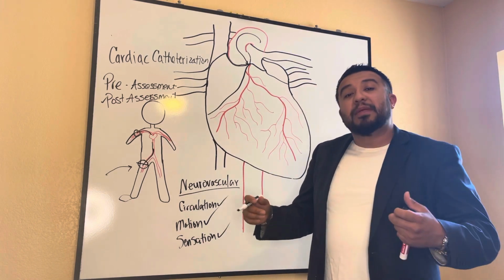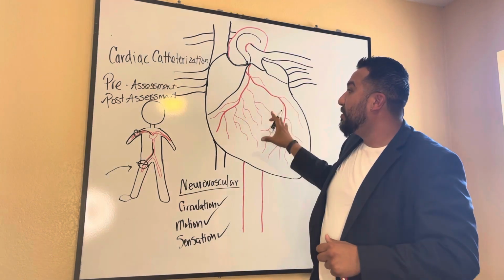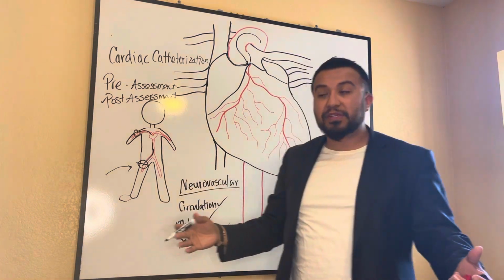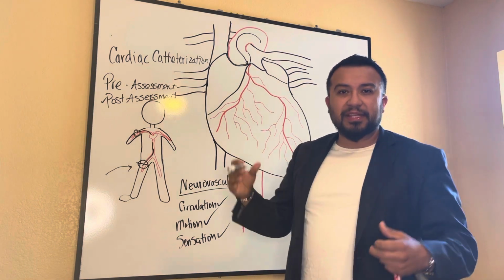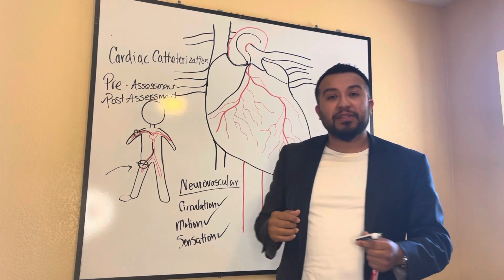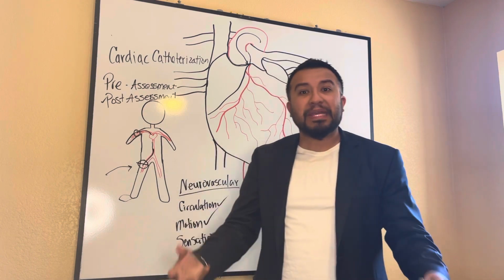You're also going to be telling them that they're going to have a little bit of a contrast medium injected into the coronary artery supply, so we can take some diagnostic imaging and diagnose the atherosclerosis if there's any present. When the contrast medium is being injected inside the circulatory system, you want to educate the patient that they may feel a warm flushing sensation, a metallic taste in their mouth, or the need to void, a warming flushing sensation that makes them want to pee almost.